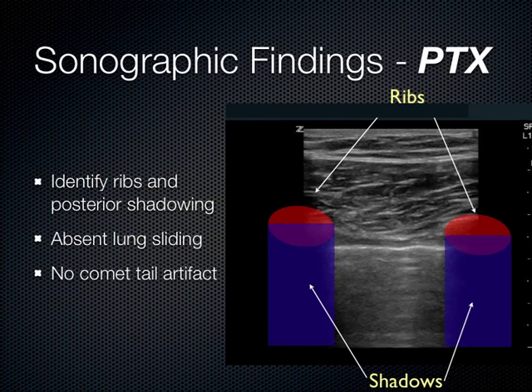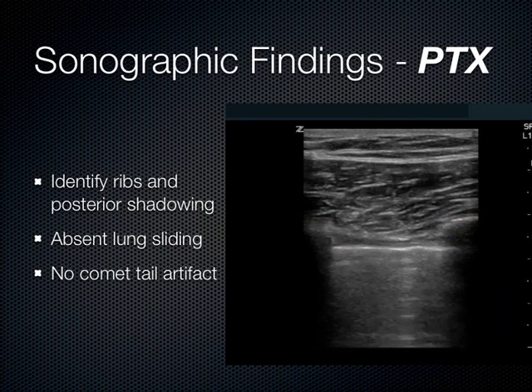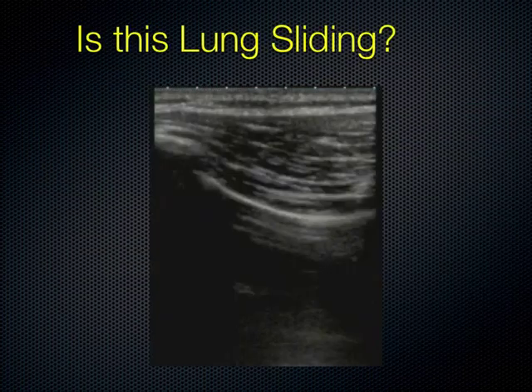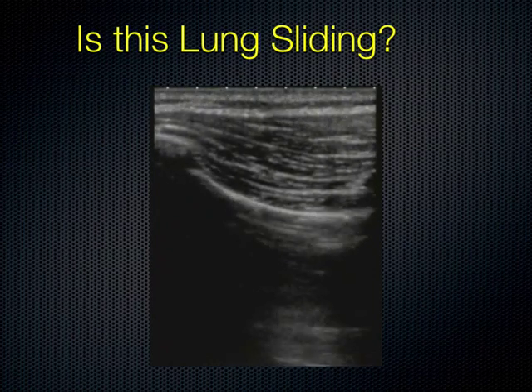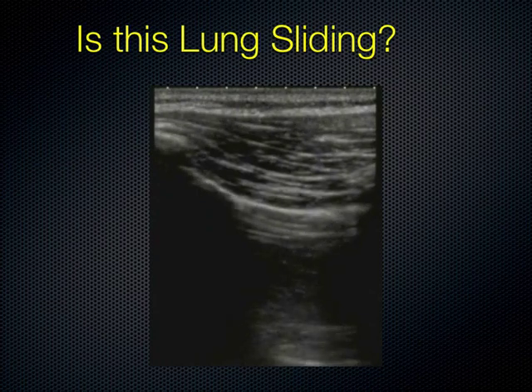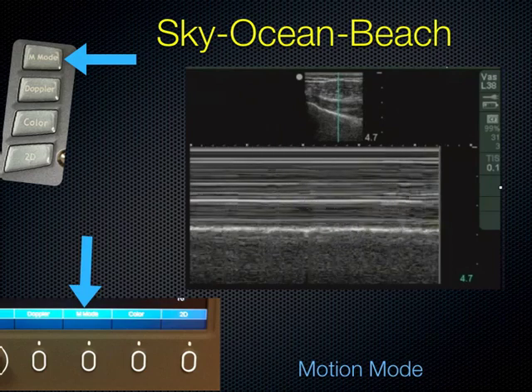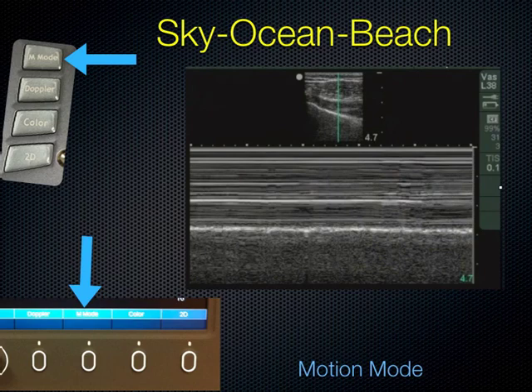If you put an M-mode line through the pleural interface and watch it over time, you get an image we call sky, ocean, beach — also called the seashore sign. The soft tissue creates a striped appearance; the pleural line is bright white like the horizon where the ocean meets the land; and if the lung is sliding underneath that pleural line, you get a grainy effect due to motion — that graininess is the beach. Sky, ocean, beach is normal. If the lung has dropped, the beach disappears because all you're getting are reverberations from soft tissue — you get a barcode or stratosphere sign.